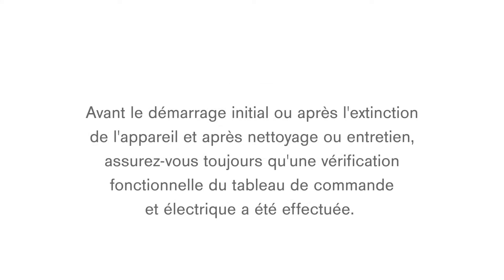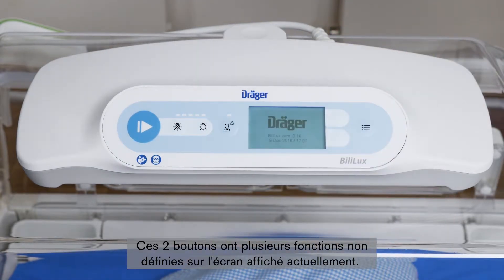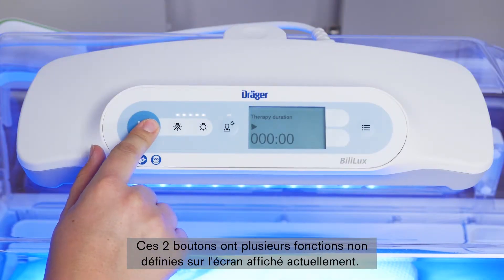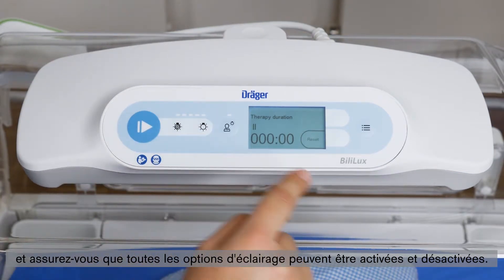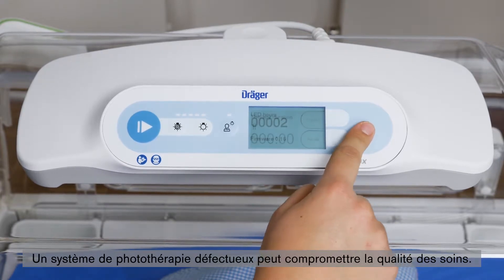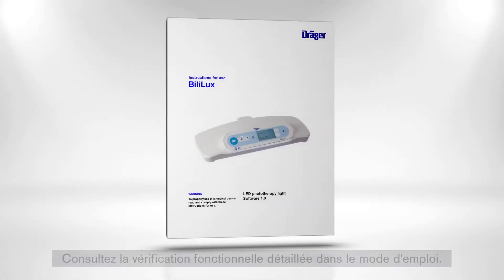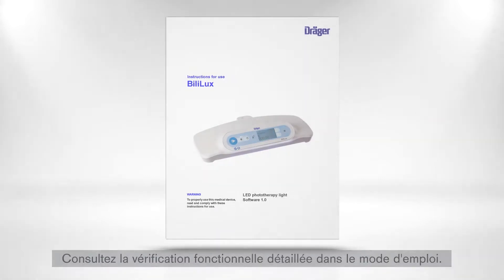Before the device is first placed into service, after it has been turned off, and after cleaning or service procedures, you always have to make sure that an electrical and control panel functional check has taken place. Confirm that all keys function properly and that all screens are displayed correctly, and make sure that all light options can be turned on and off. A malfunctioning phototherapy system may not provide correct therapy. Do not use the device if a malfunction was detected during the functional check procedure, and do not use the device if any controls are not functional. For a detailed functional check, please refer to the IFU.